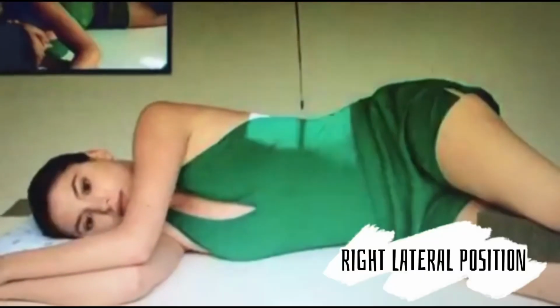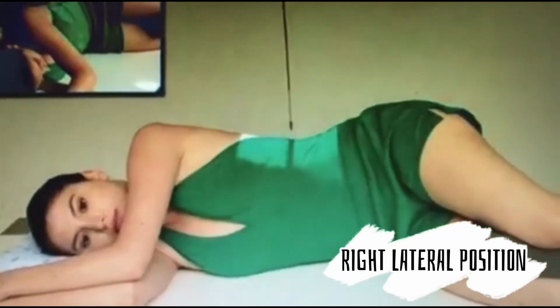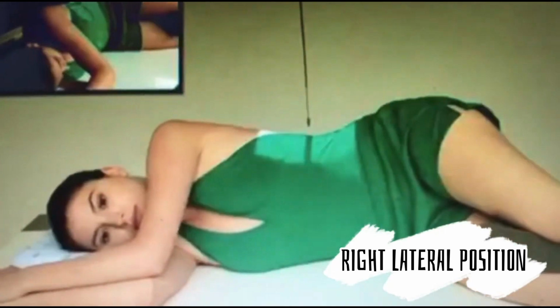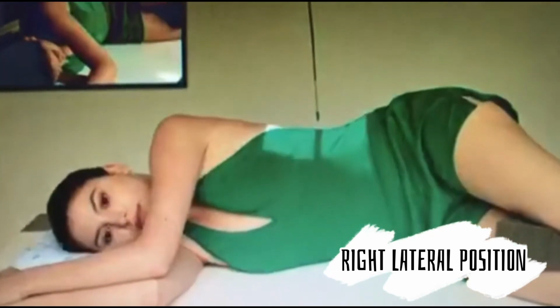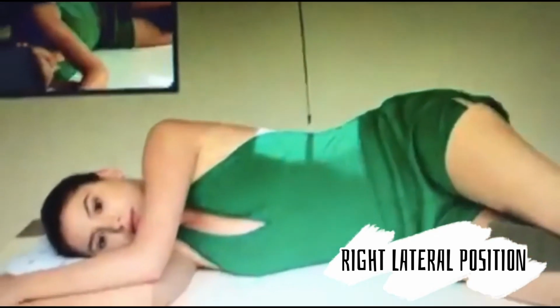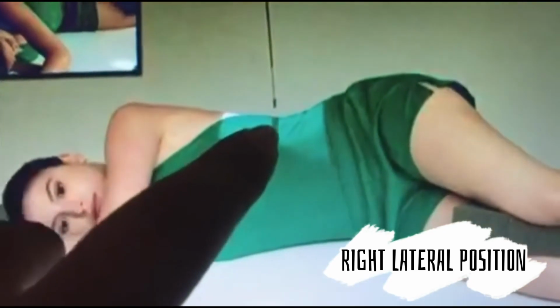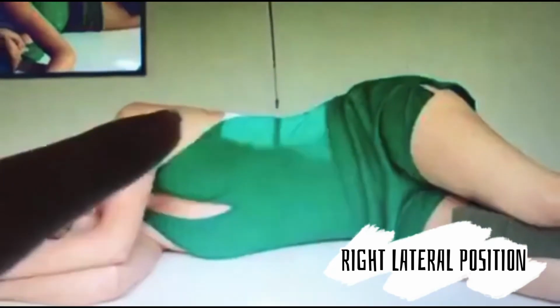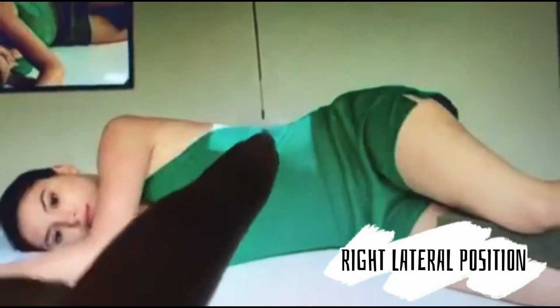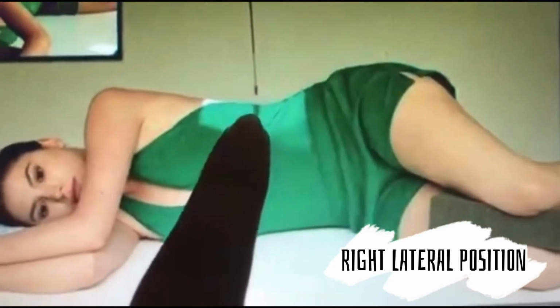Here I'm going to discuss the central ray for the right lateral position. The first body type is asthenic. Here we first locate the L1, which we determine by palpating the lower lateral margin of the ribs. We center the ray 1.5 inches anterior to the coronal plane. That is where we center the ray for this body habitus.